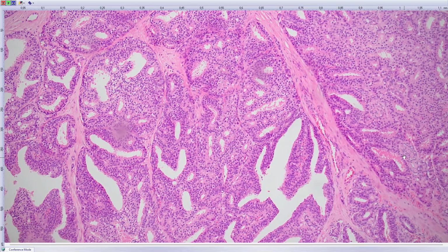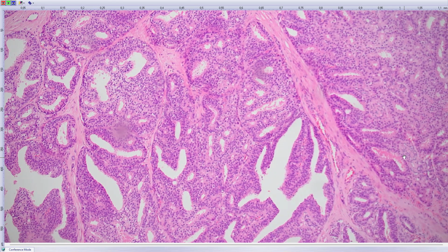Another important thing that should be known is that when prostatic adenocarcinoma metastasizes to the neck, it's always found on the left side of the neck, never on the right side. When you have it on the right side, you may be sure that it's something different. The reason is the ductus thoracicus. It always metastasizes through the ductus thoracicus. Yeah. There was one paper, I guess they had over 50 cases, and only one was found on the right side of the neck, and 49 were found on the left side of the neck. So it's a very nice thing to remember for your future practice.